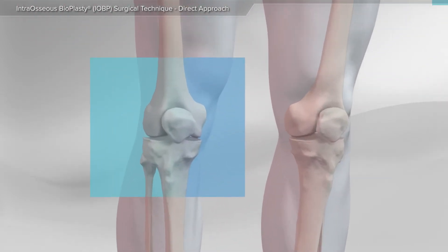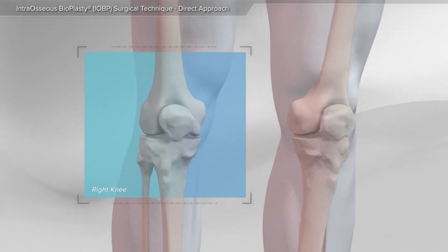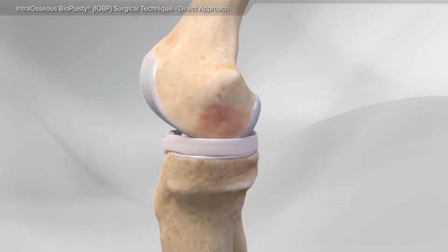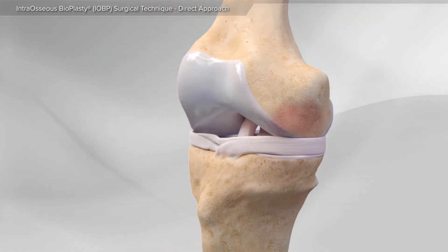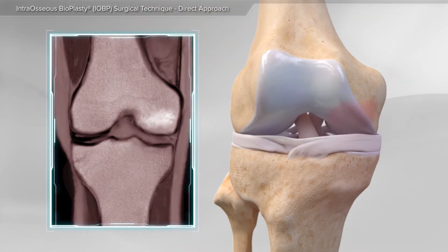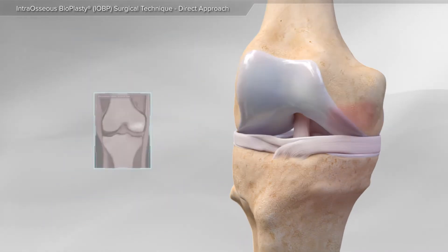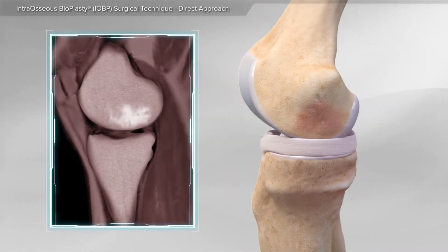In this animation, we will show a bone marrow lesion repair using the intraosseous bioplasty procedure. Pain associated with wear and tear arthritis or acute ligament injury in the knee can sometimes be attributed to bone bruising.